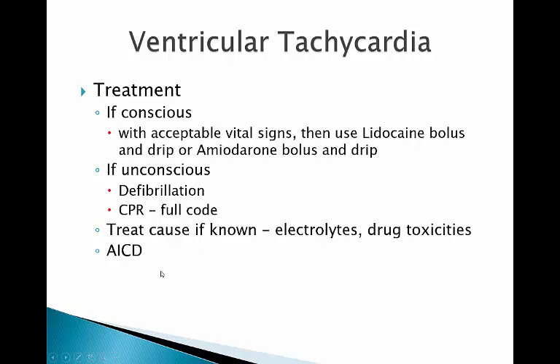The other thing that can be placed is an AICD, which is an automatic internal cardiac defibrillator, which is a little defibrillator. It's like a pacemaker defibrillator, and when it senses that the heart is going into VTach, it'll actually give little shocks to the heart to get it out of VTach and save the patient's life. Now, by little shock, I do mean a little shock, but it can actually throw the patient to the ground. So it's not a little shock to them, but in the scheme of things, it's smaller than what we normally give for a code situation.